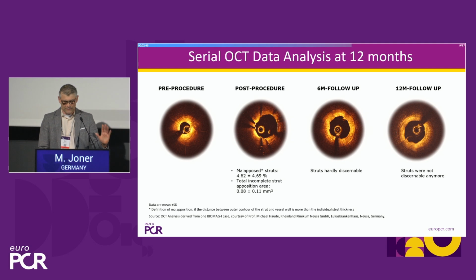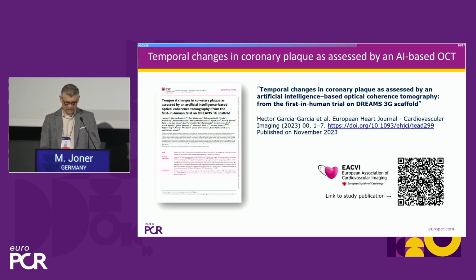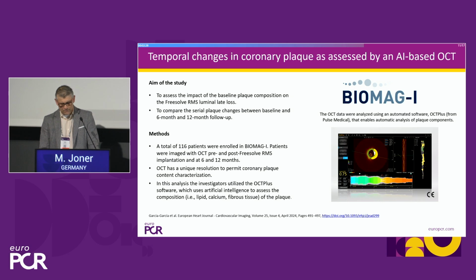Maybe now and then you see a remnant, but that's it. There is no strut dismantling, no in-the-lumen sitting of stent struts. It's covered in tissue. And then I want to show one of the studies. We had the privilege to work with Hector Garcia, and what he did basically, which was very important, he tried to understand how the tissue develops, how the underlying tissue impacts vascular healing, and how the tissue on top of the struts that is growing develops over time.